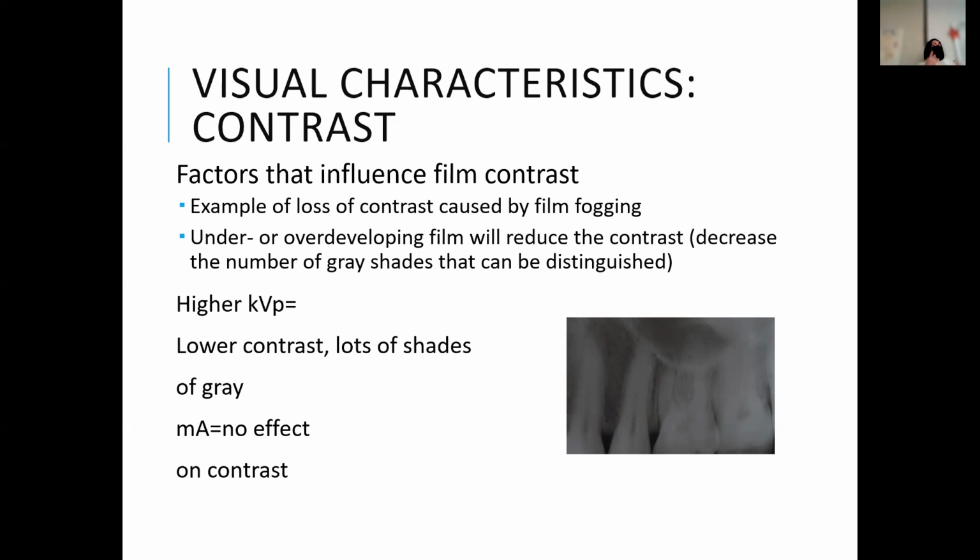So they're just highlighting here that the importance of proper developing is important with traditional films, because if it's not developed properly, then you get either a loss of all definition, or it's too dark and it conceals it. Okay.